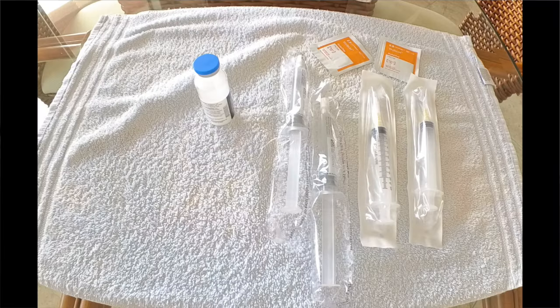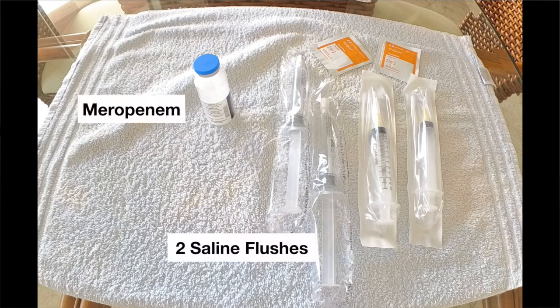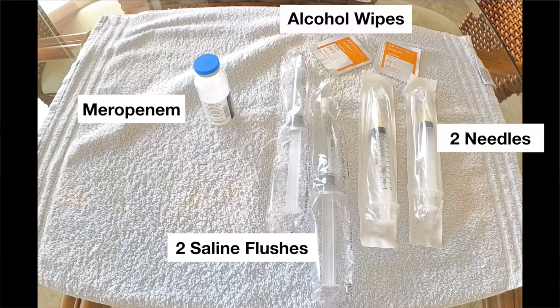So let me show you how I set out my IV medicine. The very first thing I do is set out all the supplies on a clean towel. I will need a vial of the meropenem, two saline flushes, several alcohol wipes, and two needles which fit on the saline flushes.